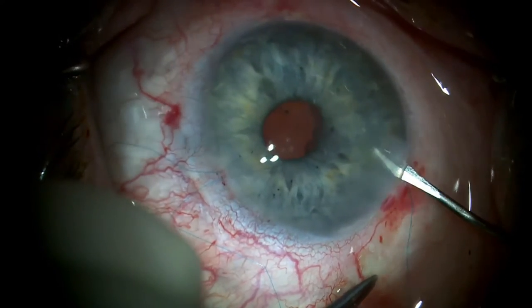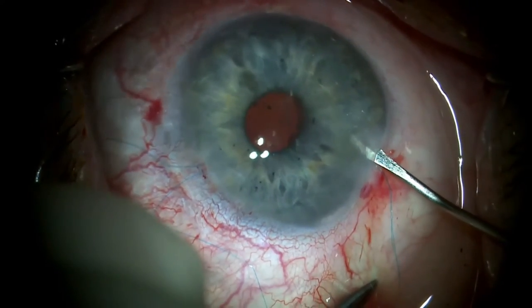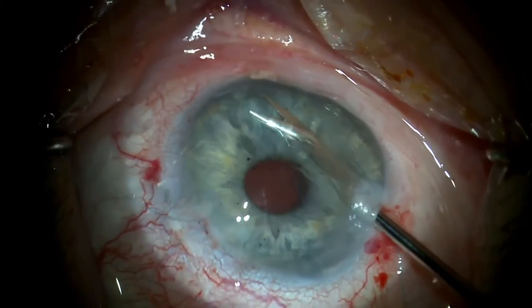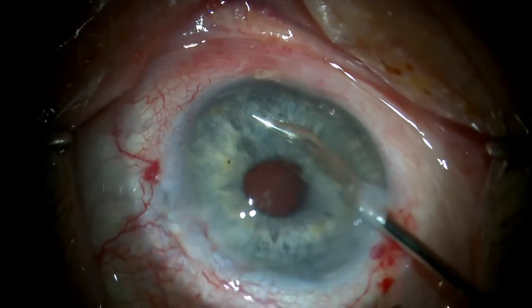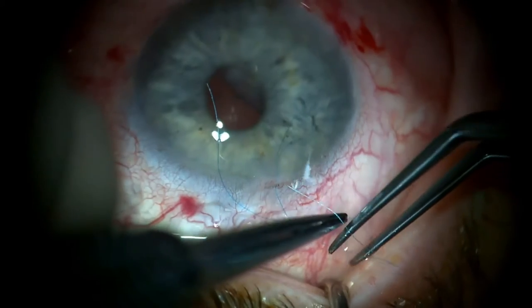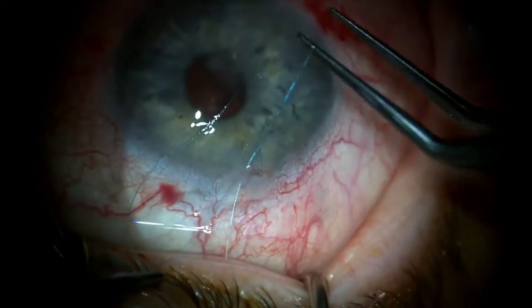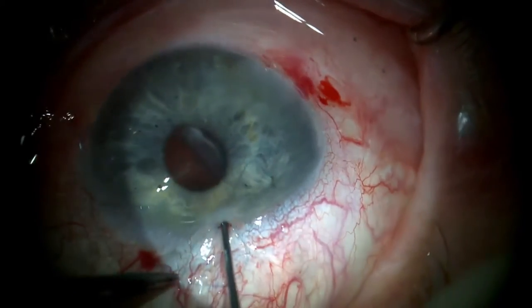Since the 23-gauge scissor was not available for this case, the paracentesis opening is enlarged slightly to accommodate a 20-gauge coaxial scissor for cutting the suture arms. The microscope is rotated again for work on the second haptic as a single-wrap throw is created and then pulled into the eye with the IOL manipulator.